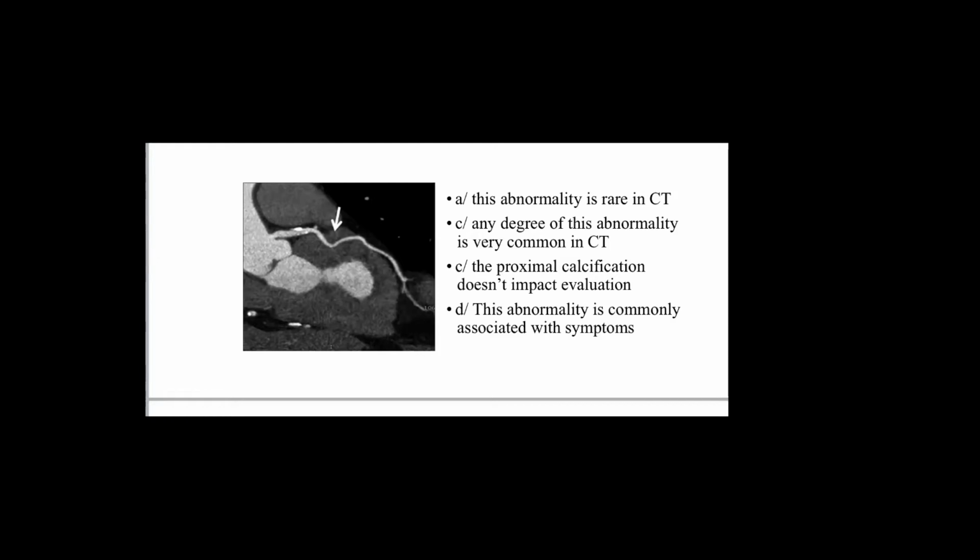That's why when you are describing bridging, you don't just say bridging. You have to tell the degree of bridging by telling how much it dives into the muscle and how long it remains tunneled inside the myocardium. Maybe that has some clinical significance, but bridging as such is not usually clinically relevant. Any degree of this abnormality is very common in CT.